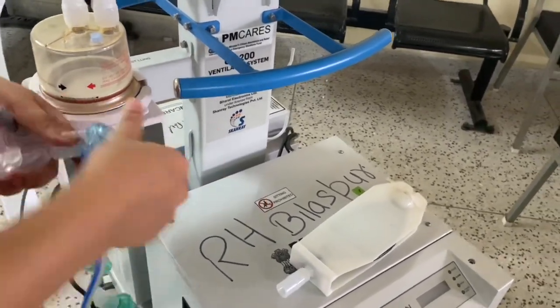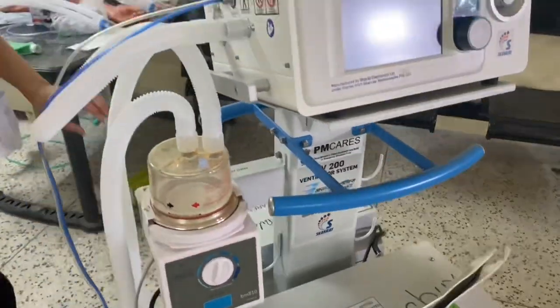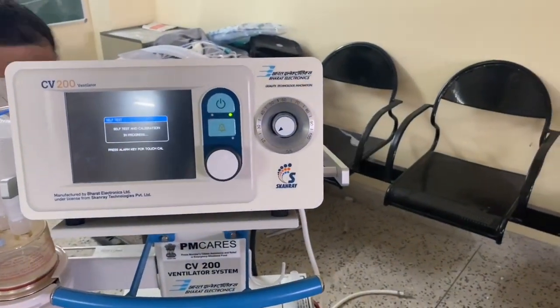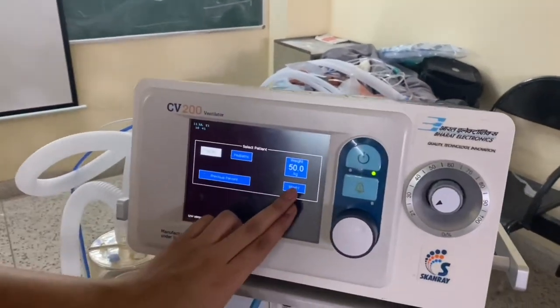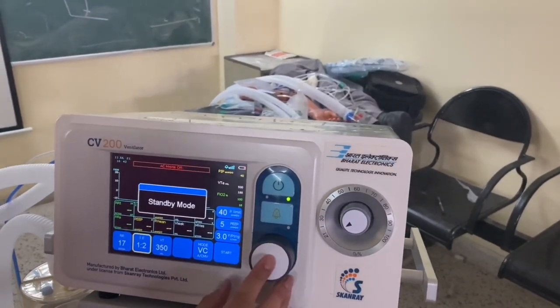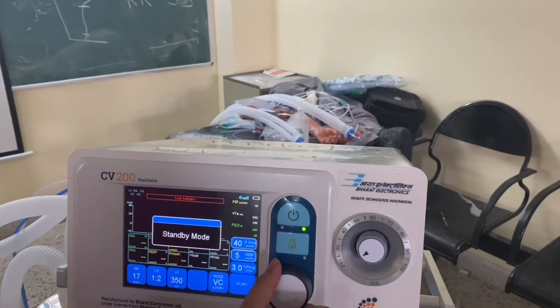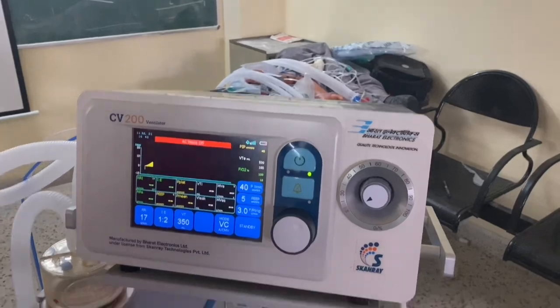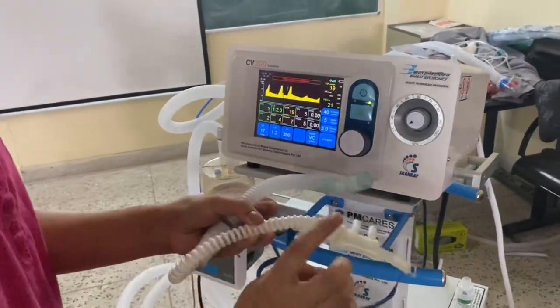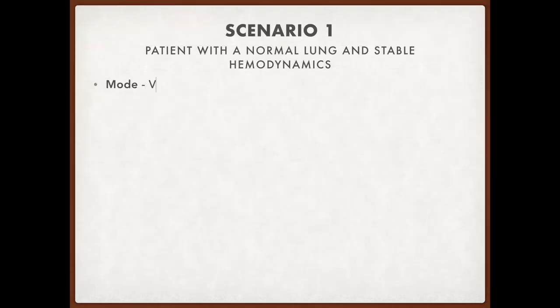Now to check the functioning of the ventilator, we have an artificial lung. Finally, switch on the compressor, switch on the ventilator, and dial in the settings.